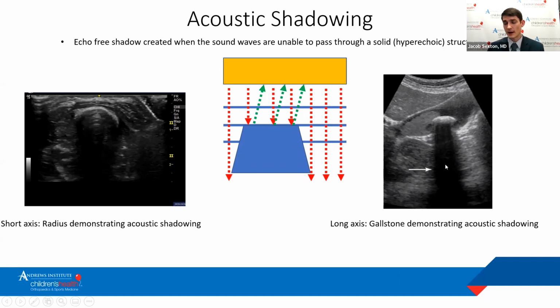We know that there's something behind there. There's just not an empty space. We know there's tissue behind it. It's just the ultrasound's not able to recognize it, giving the artifact. And this is an example of that here. Imagine this being the ultrasound transducer, these being the propagated sound waves, both laterally and medially to the hyperechoic structure, with sound waves getting bounced back immediately and reflected back to the transducer without propagation.